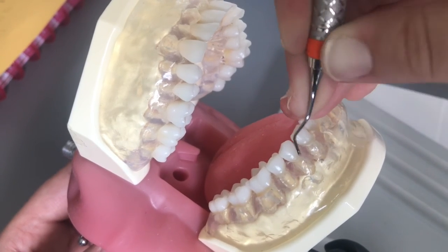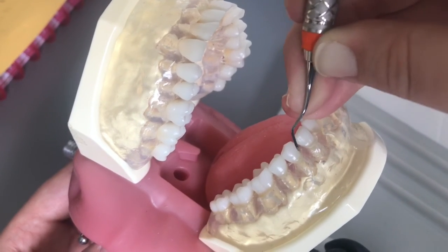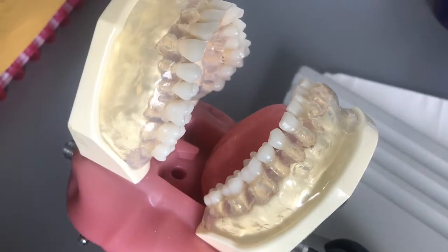Oh, pop that thumb back out. I'm working on it, I'm trying. All right, and there was my 15-16 evaluation.